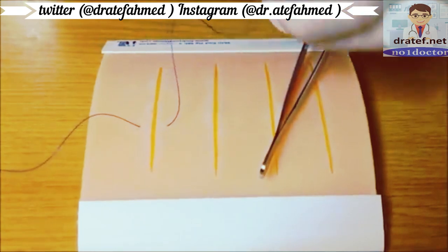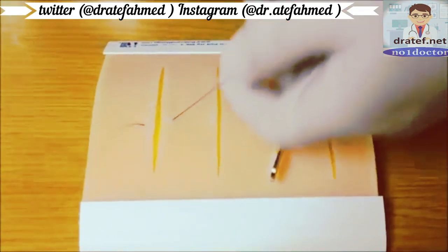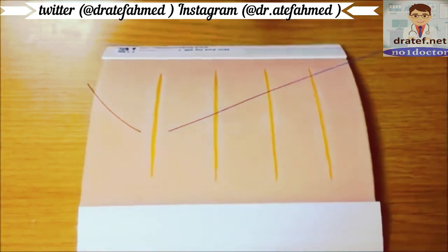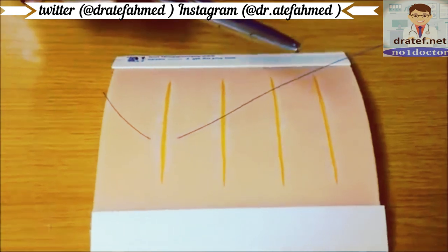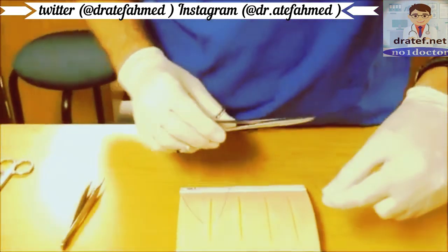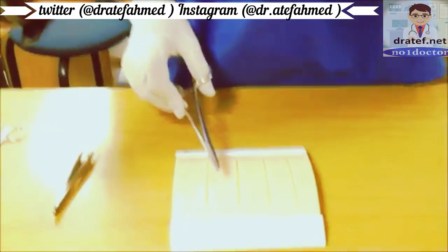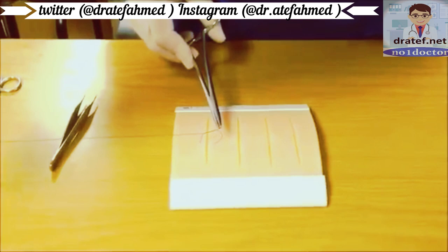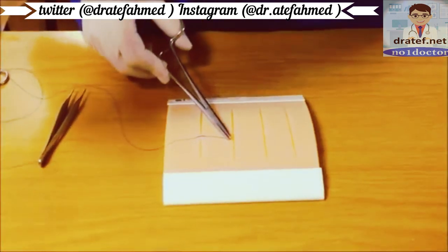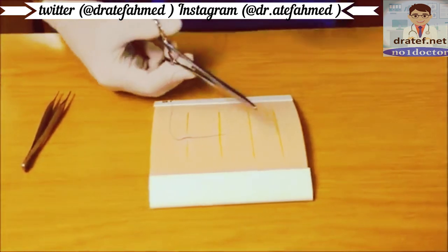You could also insert on one end, come out the middle of the wound, and insert again. Pull the suture material through, giving just enough to suture. There are many ways to tie an instrument knot — one way is to turn it twice around the instrument, grab the suture, and pull it across the wound. Only enough force should be applied to approximate the wound edges and avoid excessive tension.